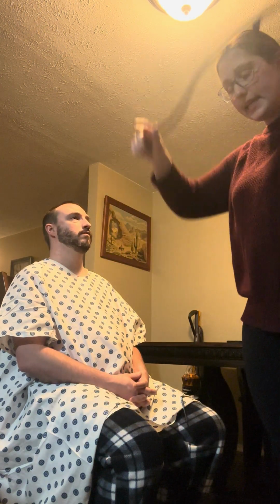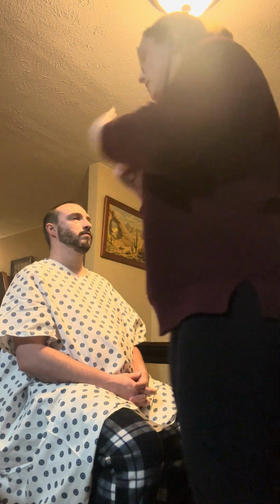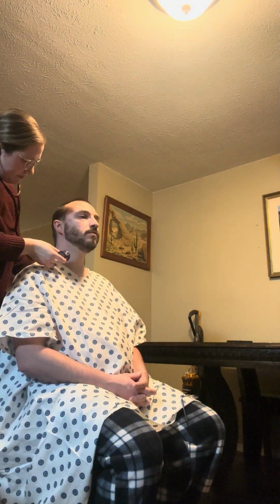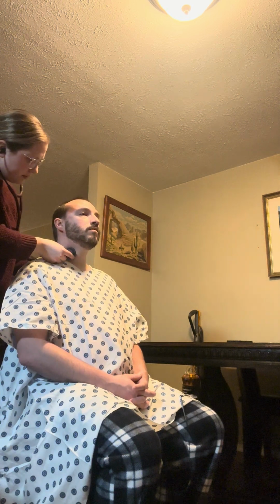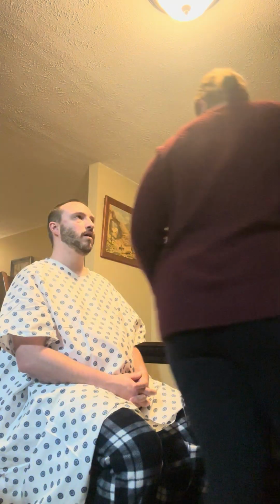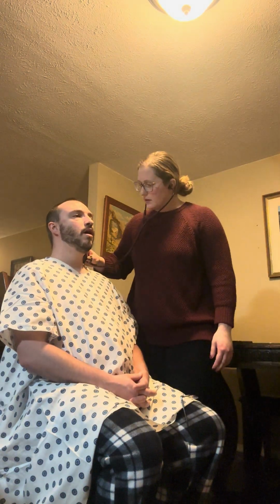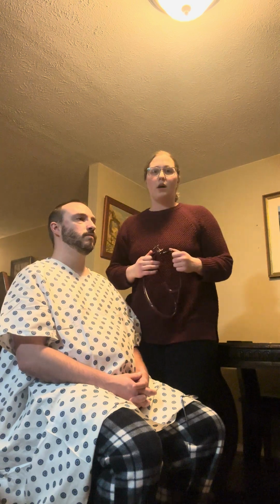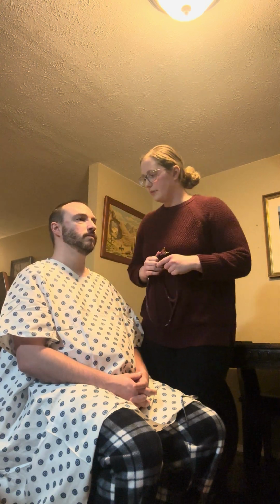I'm going to auscultate and listen to your carotid pulses. And could you take a deep breath in? And hold it. And exhale. And then I'm going to go to the other side, and could you take a deep breath in and hold it? Good. There is no carotid bruits that are noted.